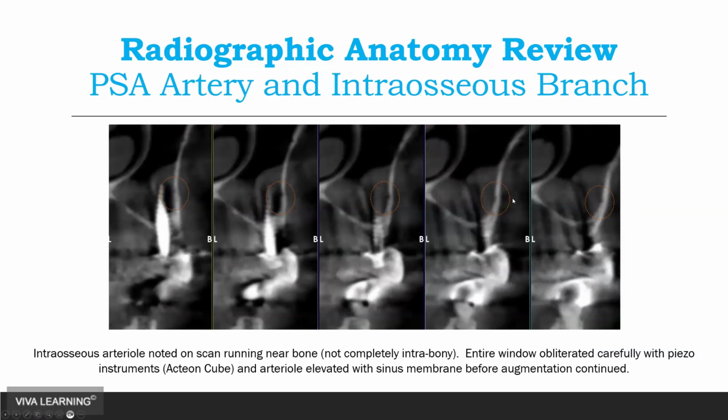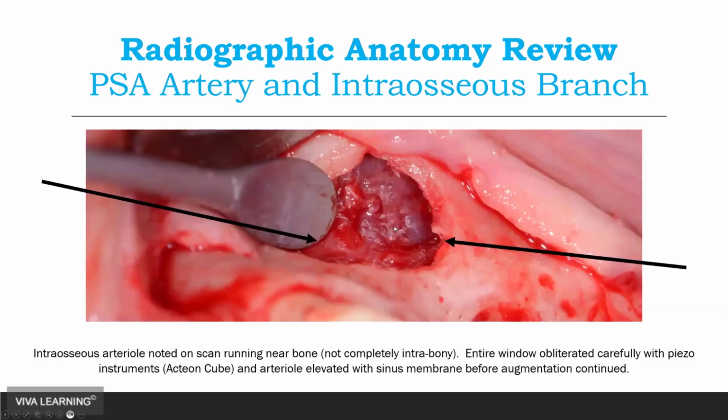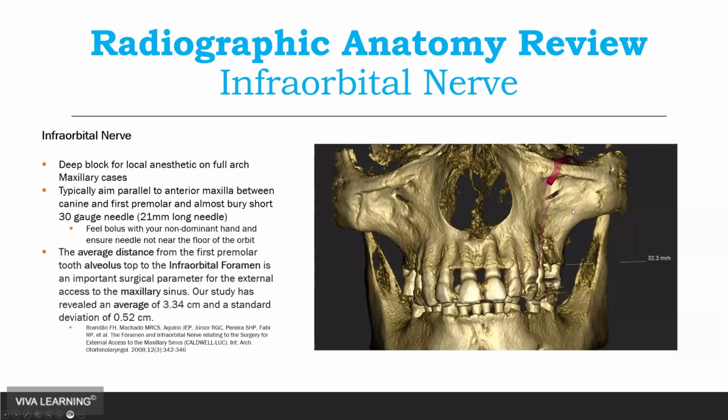Okay, this is the one we saw earlier. You could just see this little indentation. It's not an artifact. It's actually that little notch we saw, that very quite large artery going through the Schneiderian membrane.